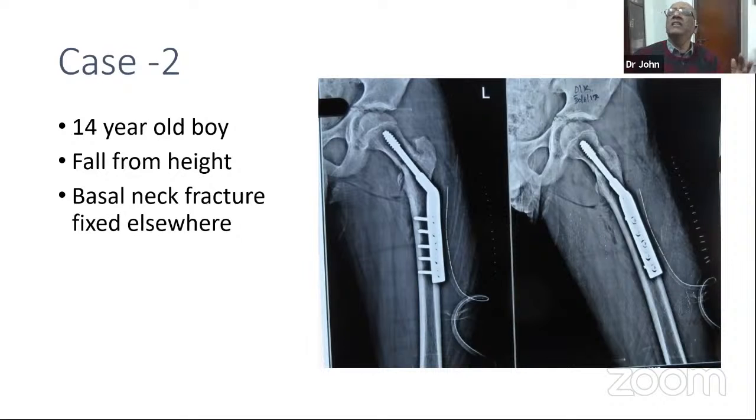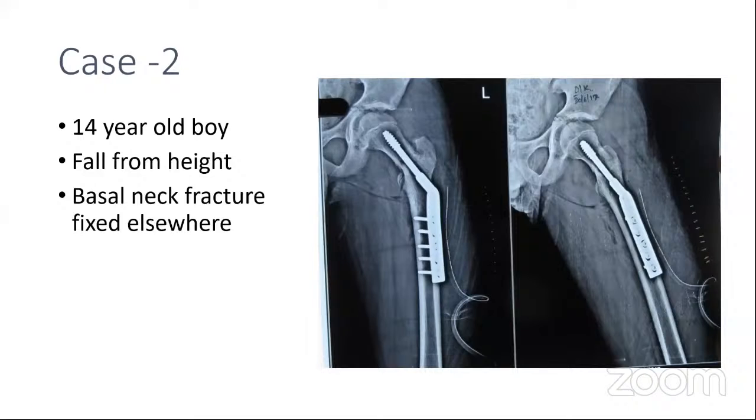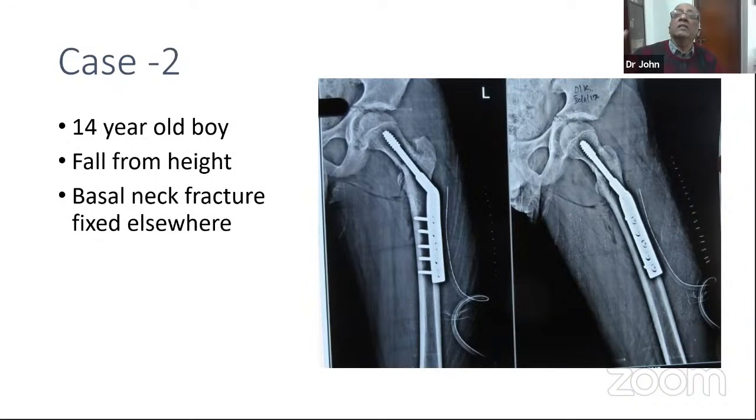If it's a 14-year-old boy, I would actually cross into the head. True, but this is nicely reduced. Just looking at this X-ray, one would probably say it's okay. I'm not sure if he compressed or not. John, do you think the barrel and the length of the screw, there is an angulation there? It's not going to telescope really. Yeah, so that's what I'm saying.